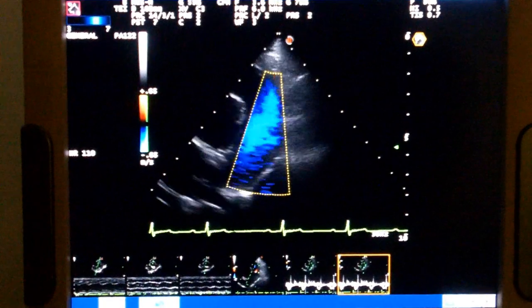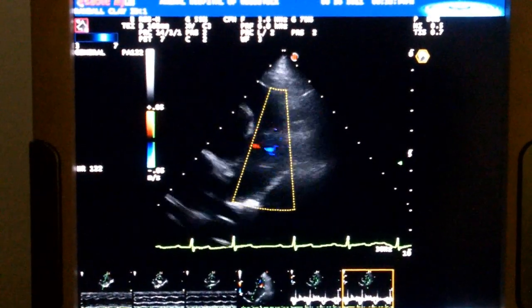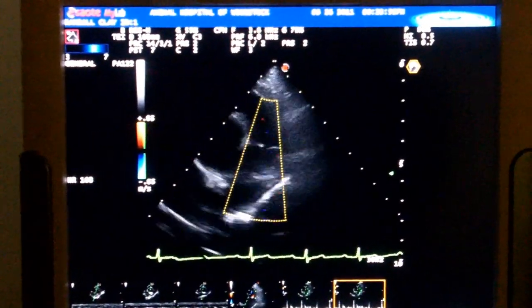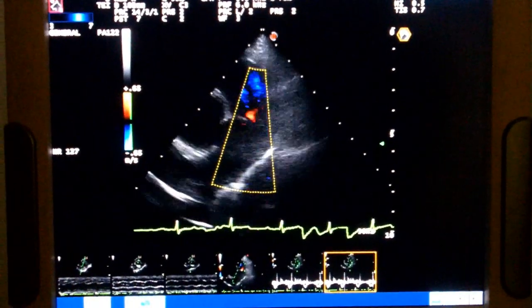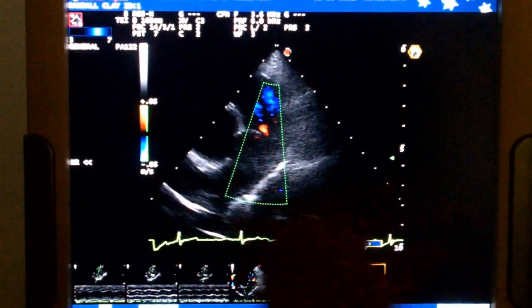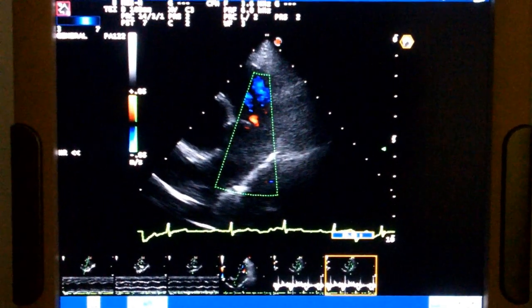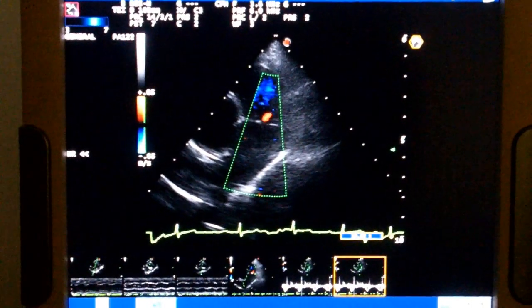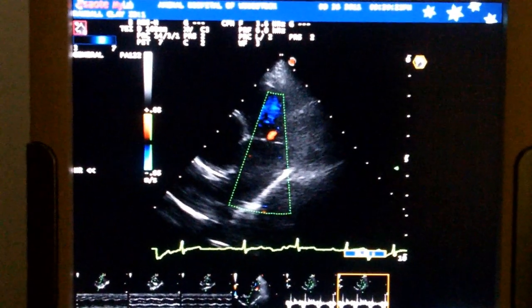We're going to flip him over. Again, you can see the pulmonary insufficiency there — it's not very big. One meter per second on a human would be just like that; everybody has it. We won't worry about that. But it's a relatively insignificant lesion, within the normal physiological norm. To be able to get that to display as well as it did speaks to the sensitivity of the machine — even a minor lesion you can get a measurement off of. And that's great if you have a concern about pulmonary hypertension.